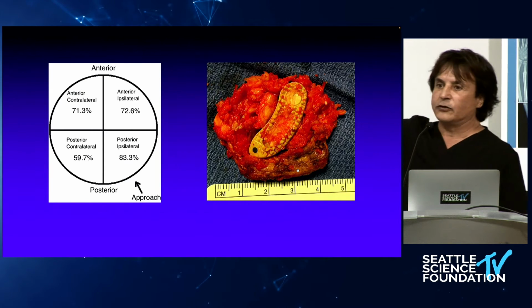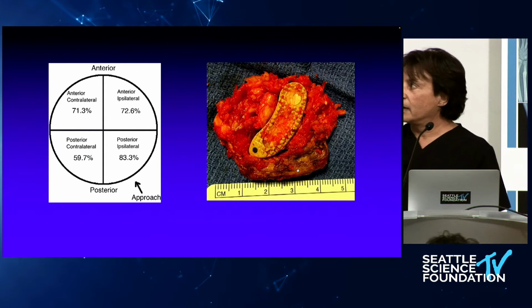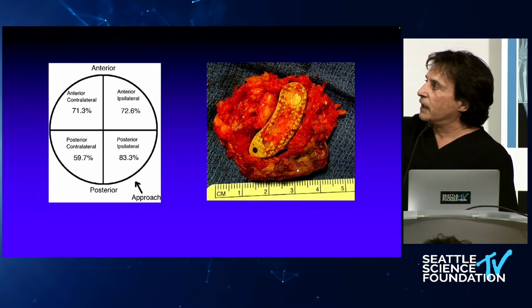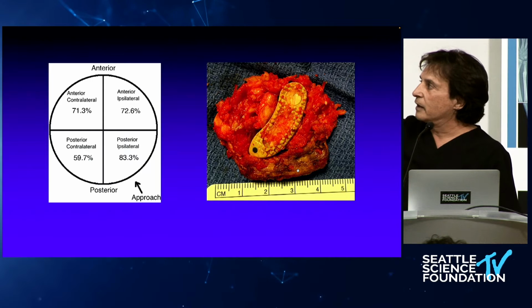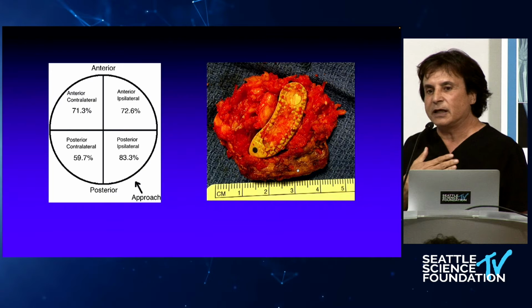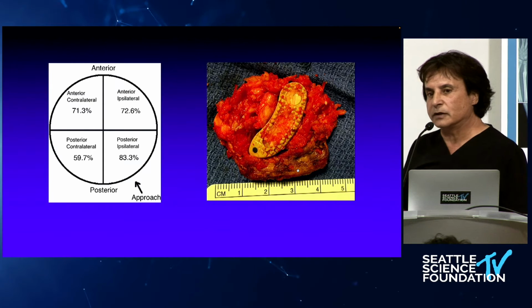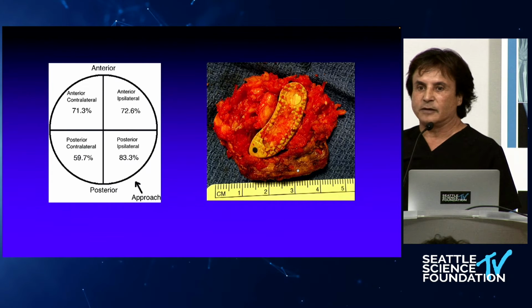And I can't tell you how many ALIFs I've done for failed TLIFs and PLIFs. And this is Pierce Nunley, my buddy, and this is a TLIF that he reconstructed on the back table when he salvaged it from the front, and you basically reconstituted the entire disc. So to me, oftentimes, and not in the hands of Steve Glassman or others that are hugely experienced in this operation, but really what you're ending up is a channel discectomy.